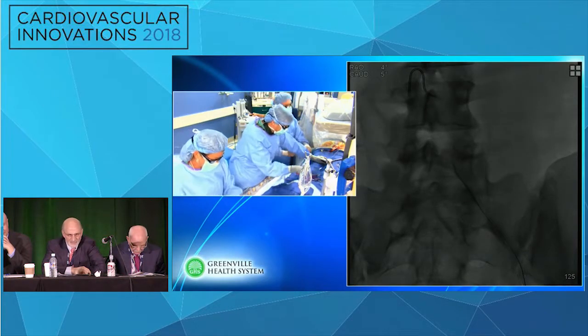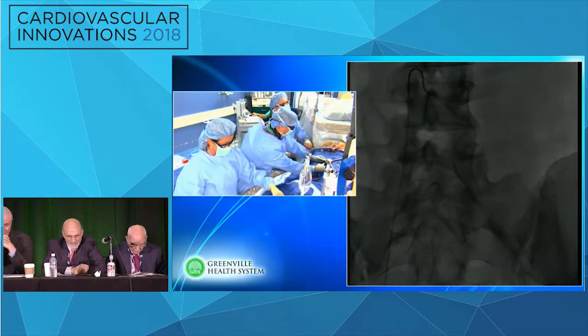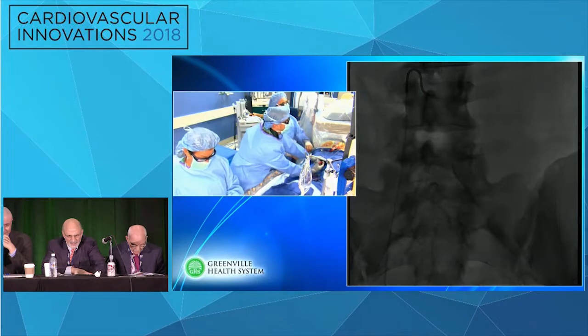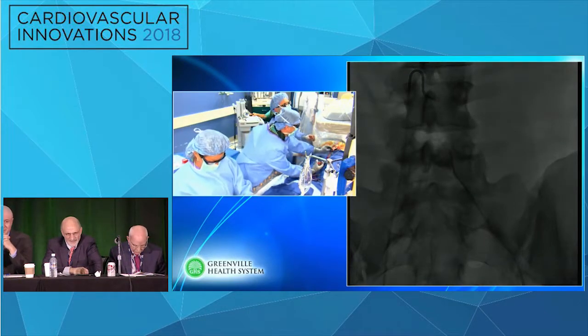Far out, you think this is a branch? Yes. Looks like a branch, too horizontal. Anyone who thinks this is the nub? No? Munir? It's too high. It's too high.